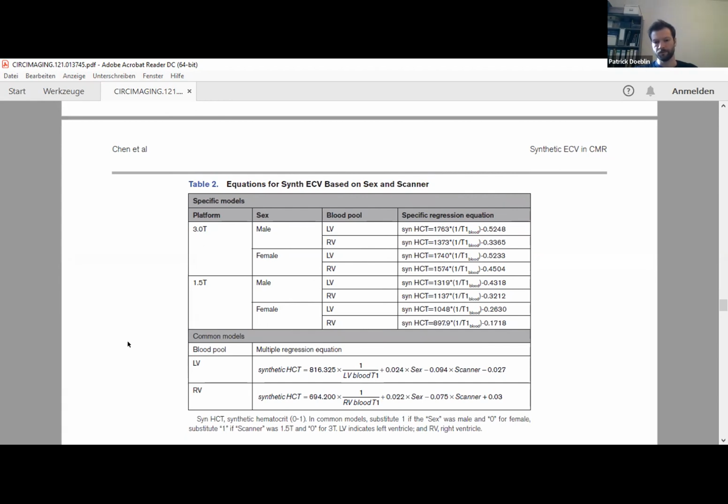Okay. So at McGill we actually have data from what we call the 3 scanner study, where we compared 3 different scanners with the very same people and with T1s. So we could certainly run that and compare 1.5 versus 3 versus different vendors, and see how much this affects the actual measured hematocrit. It's an easy analysis. You usually have all the data you need from the images.